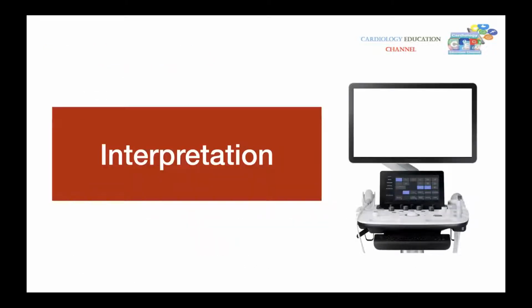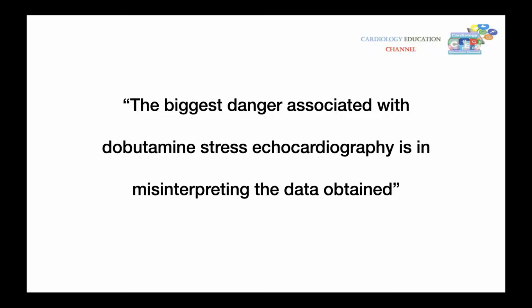So let's come to the important part, the assessment or interpretation of the findings from the test itself. I can safely say that the biggest danger associated with dobutamine stress echocardiography is misinterpreting the data obtained, because dobutamine stress echo is really operator dependent, either in the acquisition or the interpretation. So the main enemy of dobutamine stress echocardiography is misinterpretation of the data.